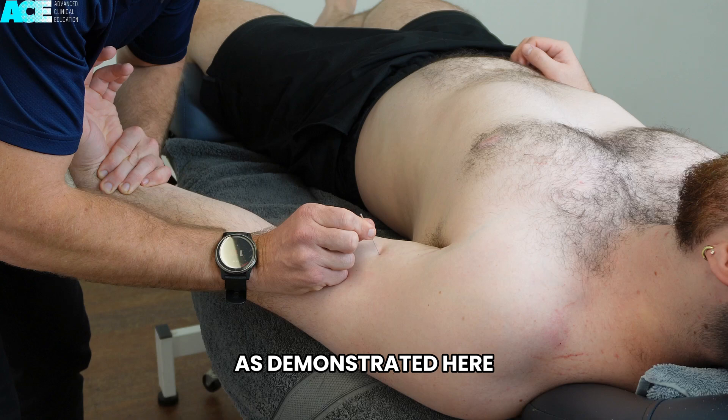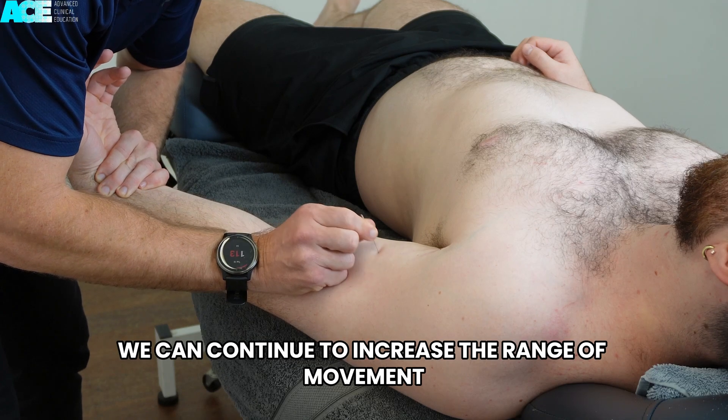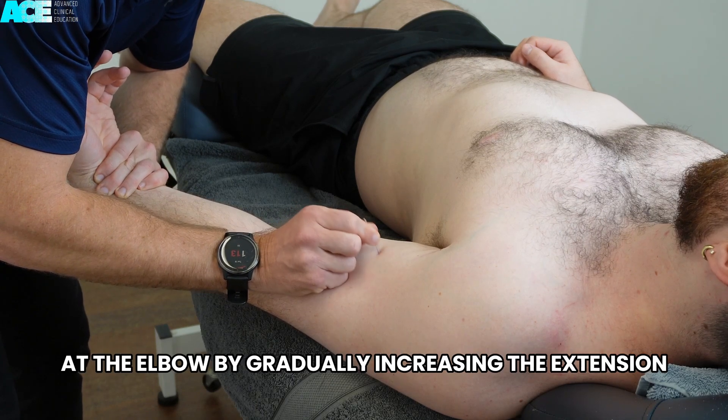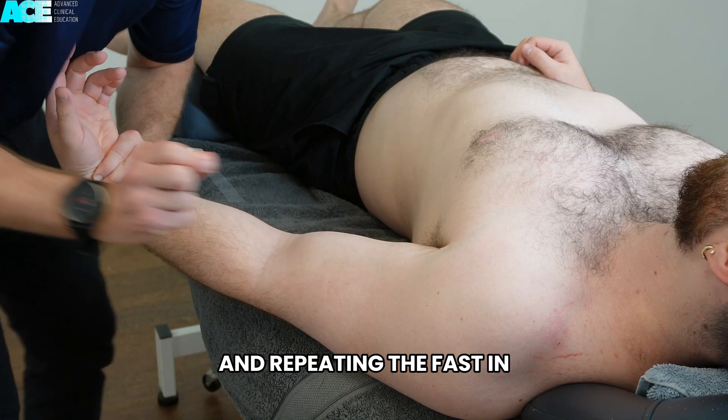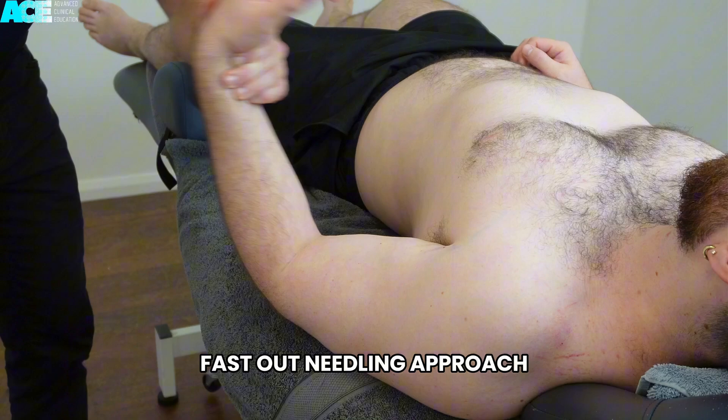As demonstrated here, we can continue to increase the range of movement at the elbow by gradually increasing the extension and repeating the fast in, fast out needling approach.